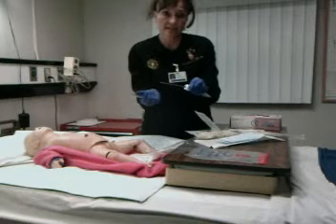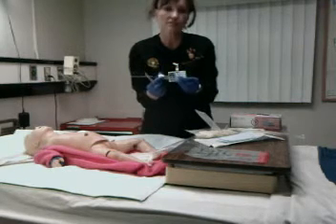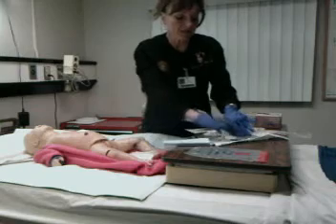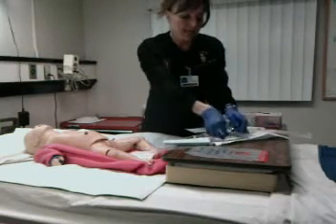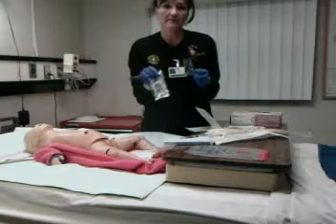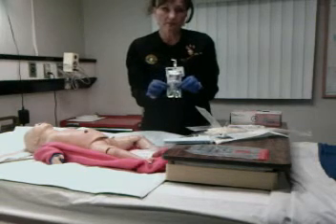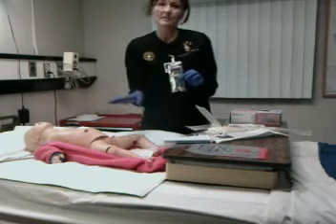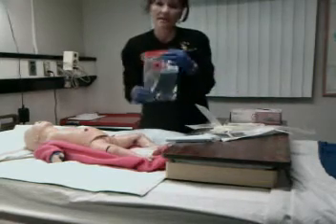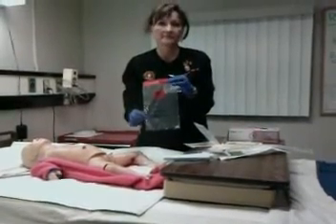This kit is pre-assembled, so you would go ahead and open it up. Inside the kit you'll notice — everything is on a plastic bag — are your sterile gloves, a label for the urine specimen, and then here is your straight cath kit. If I pull this off, that is actually the straight cath. The directions inside say that sometimes you have to loosen the cap because it's on tight, to avoid too much suction. You'll also notice there is a sterile drape, the KY or water-soluble lubricant, and povidine iodine swab sticks. Key to remember: we will not use KY lubricant on our mannequin because the mannequins don't tolerate it well.